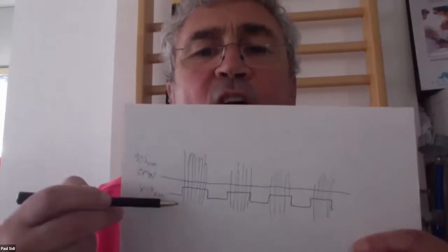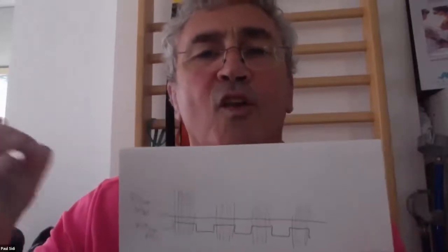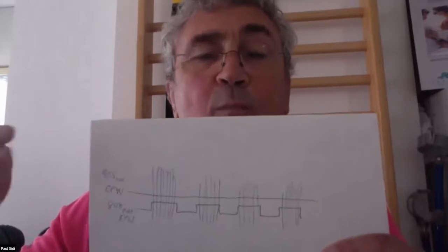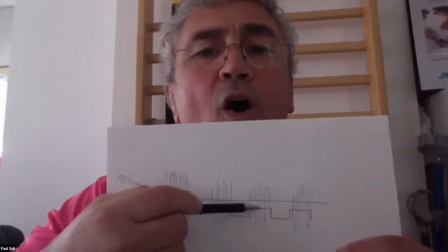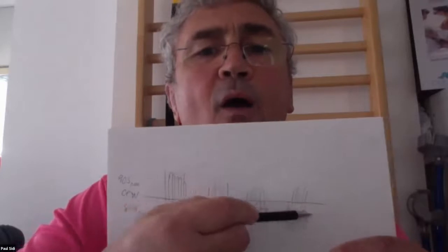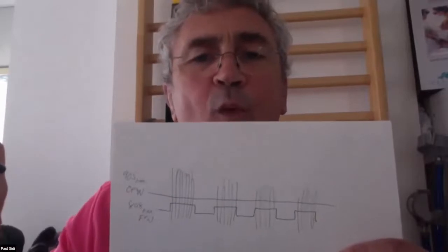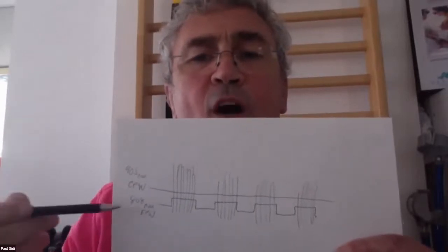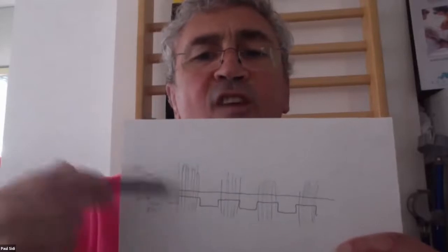What's happening then? Every time this is on, you got ding, ding, ding, ding, right through this, nanosecond, loads of them. When we're talking about hertz, say 2000 hertz, that is nothing compared to nanoseconds. So one is really, truly super pulse, and one is basically continuous. But you got this on like mad, off, on, going like crazy. What happens when we press the CPW is it actually removes the hertz. We no longer have any element of hertz, and it is just a continuous light going through there at 1.1 watts, and then this is going through continuous as well. So you automatically just double up the joules which are going into the tissues straight away.